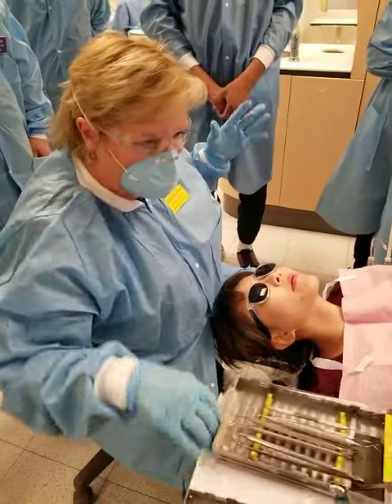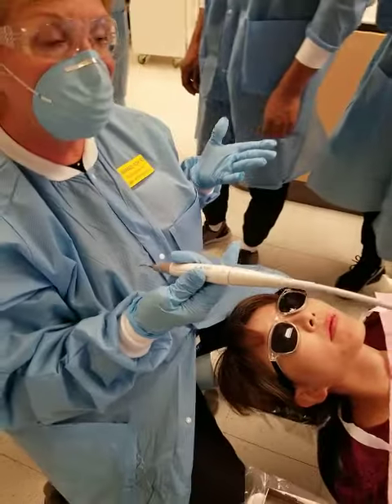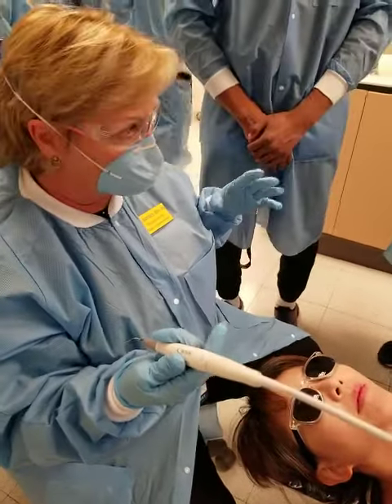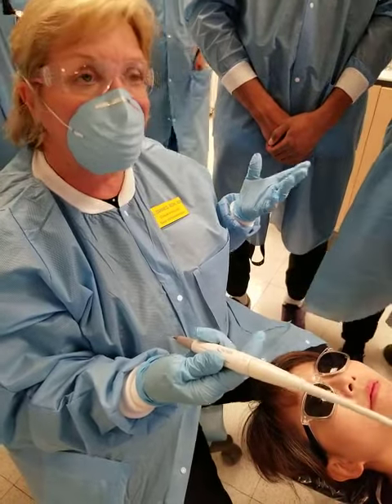So let's just talk about the piezo and the polishing, and then we'll be done. We're going to recommend the piezo when there's heavy calculus that you need to remove. Whenever you use piezo, you have to go back and do your hand instruments.